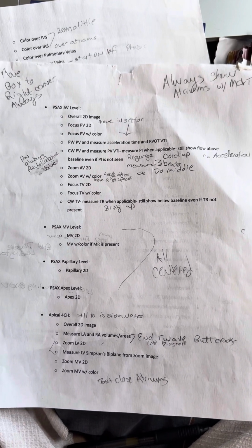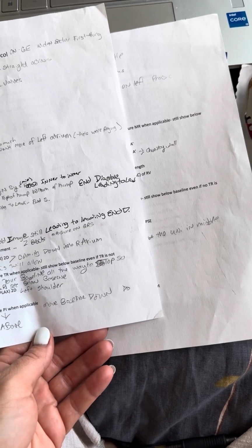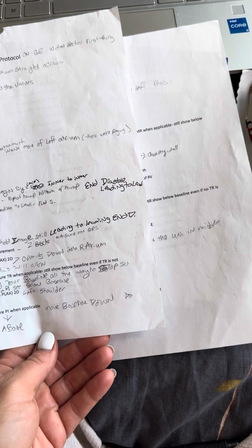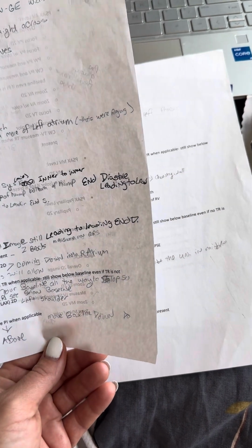When you did your pulse wave for your PV, make sure the pulse wave is always right above the valve. Pulse wave will also be your acceleration. You want to move your baseline down.